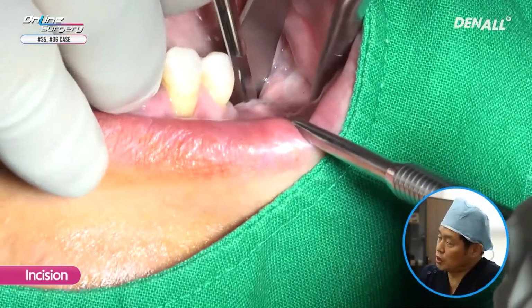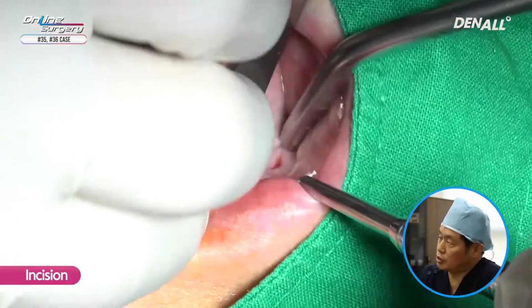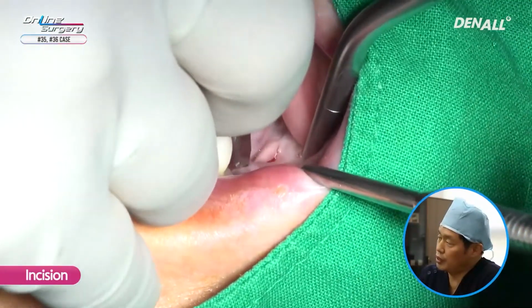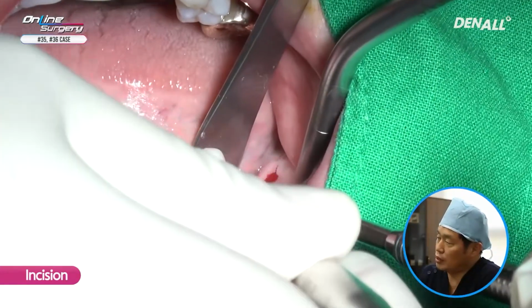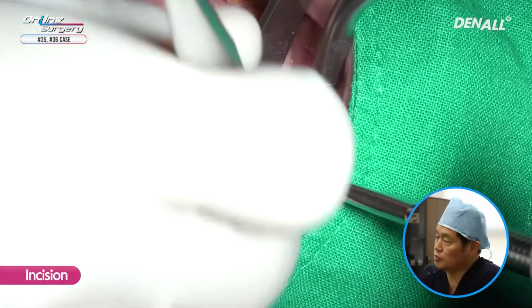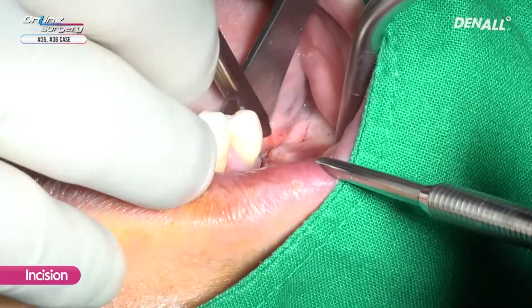There was insufficient attached gingiva and GBR was planned. Although OneGuide will be used, an incision was made and surgery was proceeded with a slightly reflected flap.